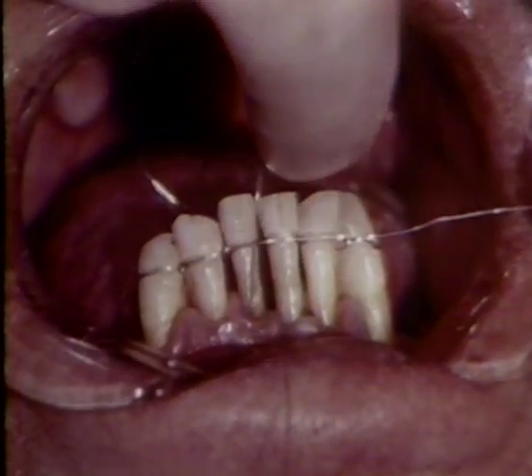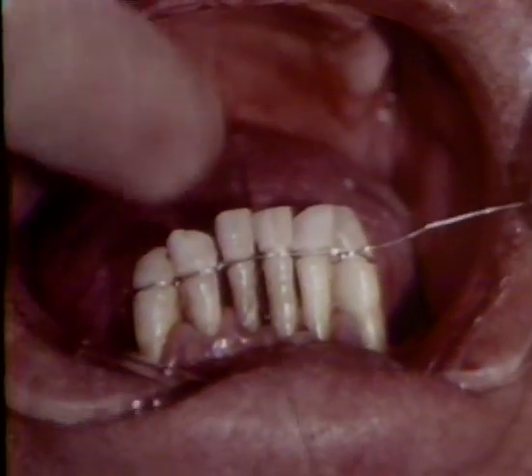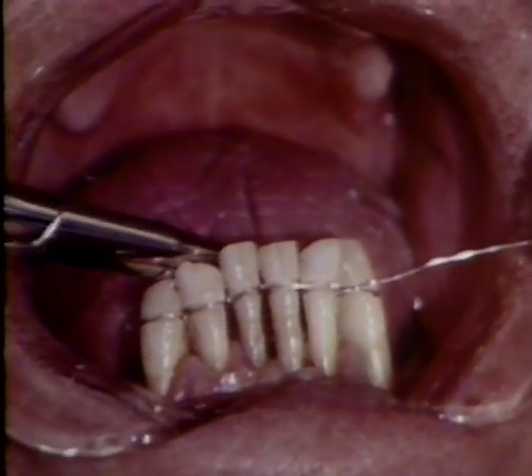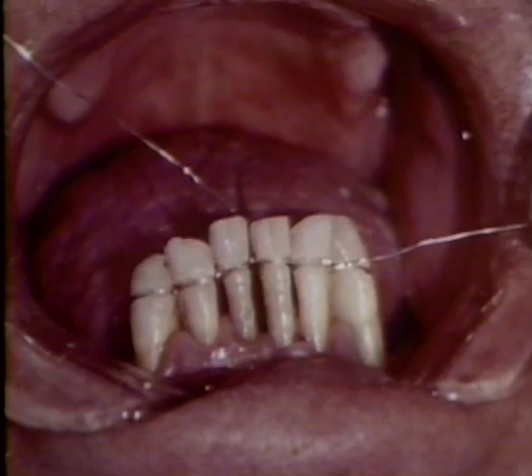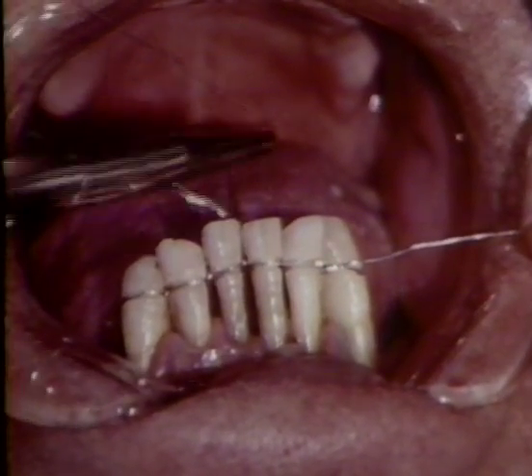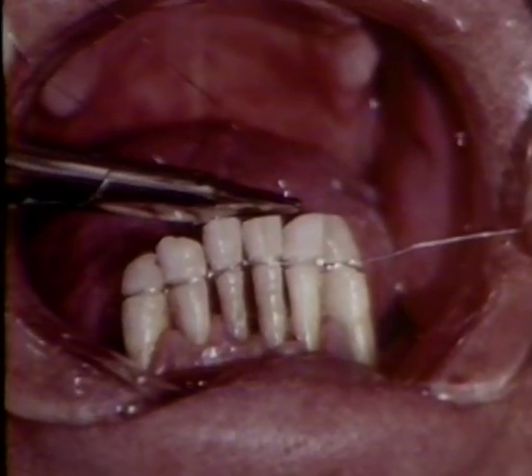This method of stabilization immobilizes the entire segment of teeth and is not aesthetically undesirable because the wire is ultimately covered with a plastic material. This plastic not only helps to stabilize the teeth and improve the aesthetics, but it also prevents any irritation to the lip, tongue, or mucosal surfaces.